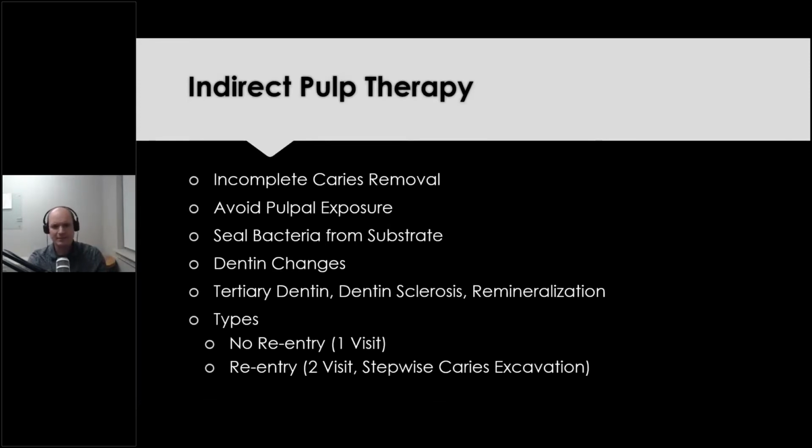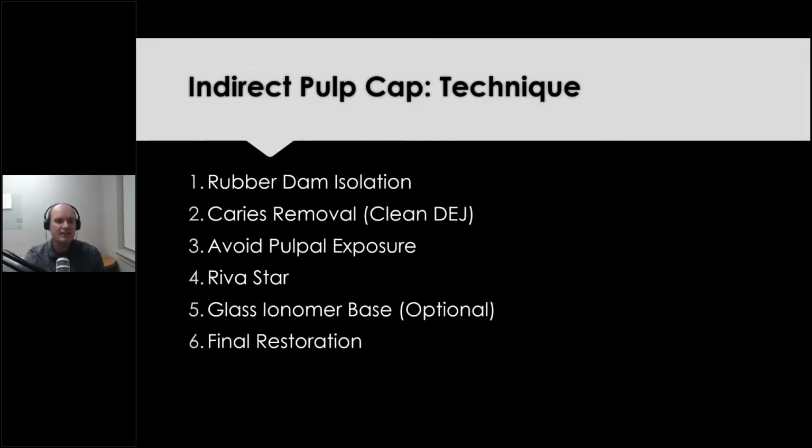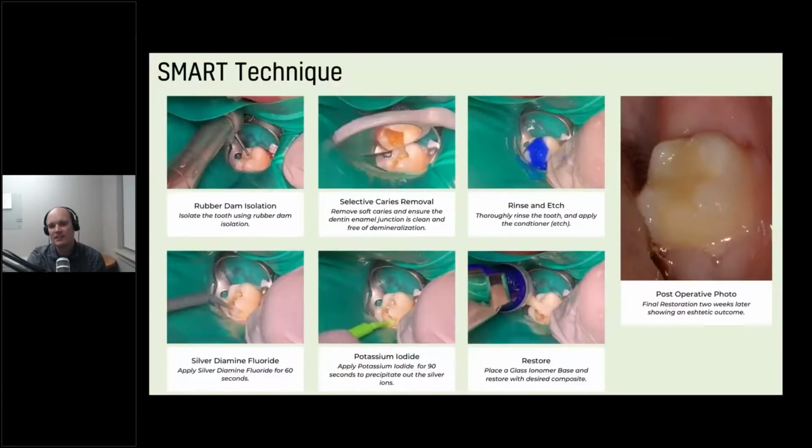There's 2 different types, 1 visit versus 2. We know now that you're better off just doing 1 visit for all this therapy and being done, whatever you plan to be your final restoration. You're better off placing that at the same time. So this is the SMART technique.